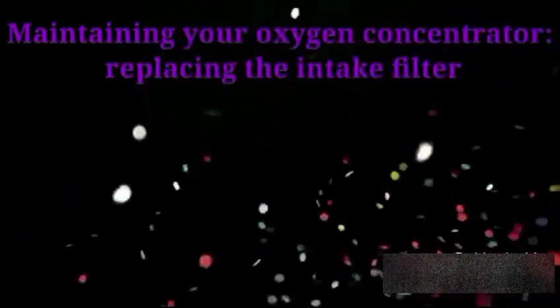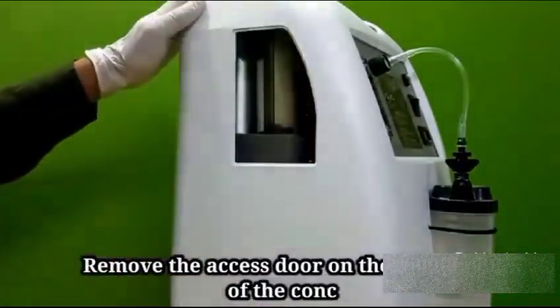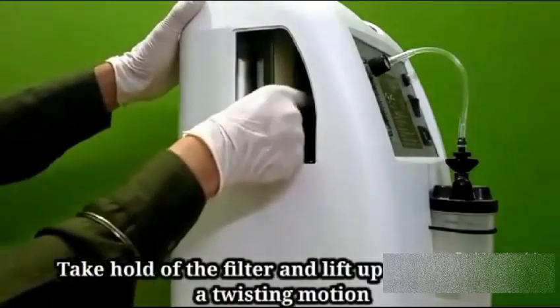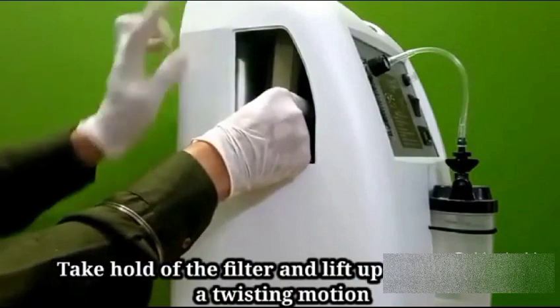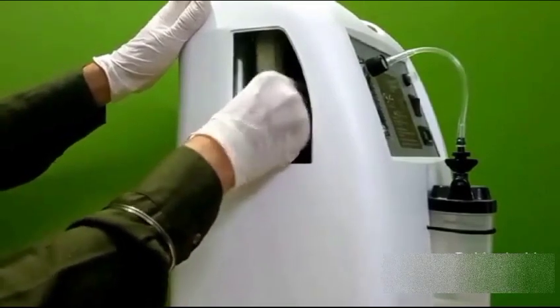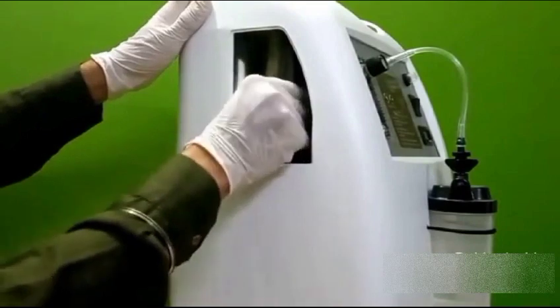Now we'll look at the intake filter inside. You will remove the side cover back. Here you can see a filter. By making a little twist, you will pull it upwards and keep feeding this a little with your hands, and also you will pull this upwards, so this filter will go out.